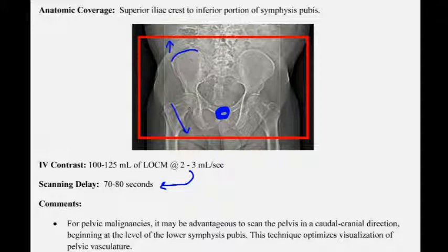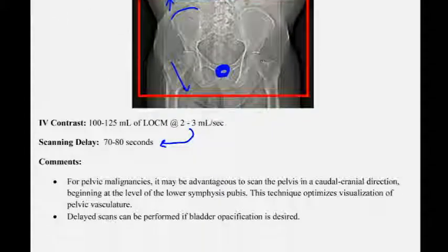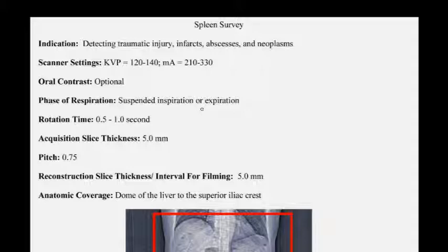So sometimes it's very interesting just to see the opacification, and especially even for males, because if the prostate has enlarged to the extent that it's encroaching into the bladder, then it will allow you to see that. But also, if you have bladder cancer, it allows you to really see an indentation of the bladder where this mass actually is. So it's very important in most facilities.